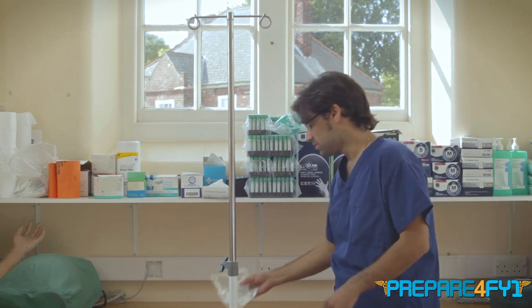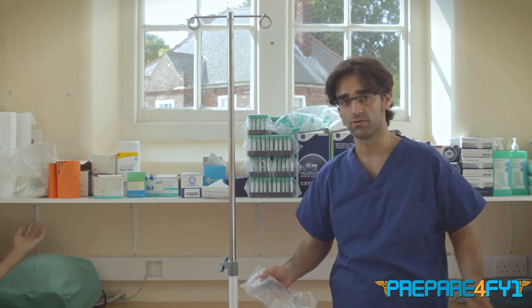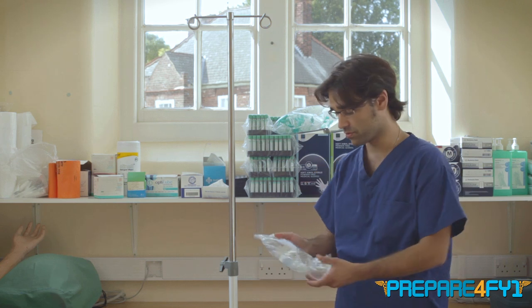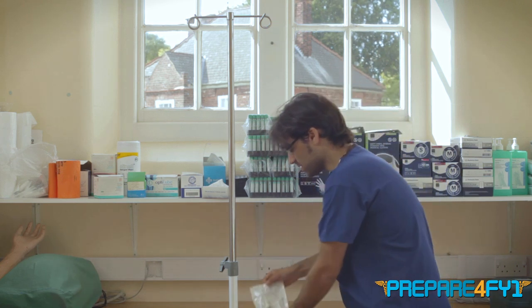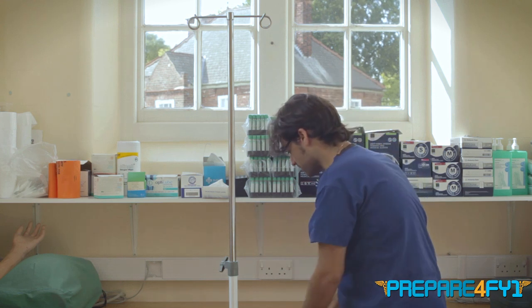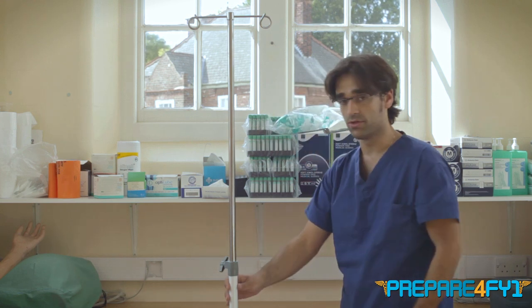You need three things to do it properly, in addition to a sterile trolley which you would have on the wards. You need bags of fluid, you need a giving set, and you need some sterile gloves, ideally in addition to a drip stand.